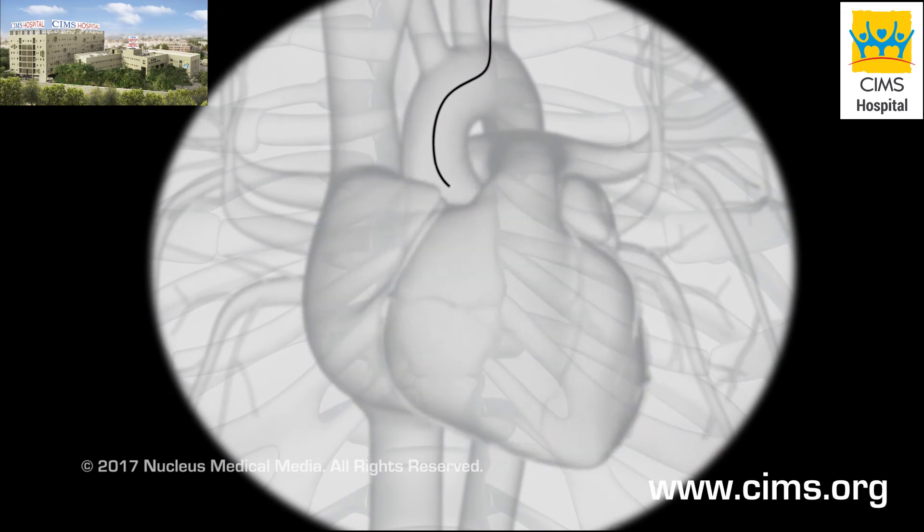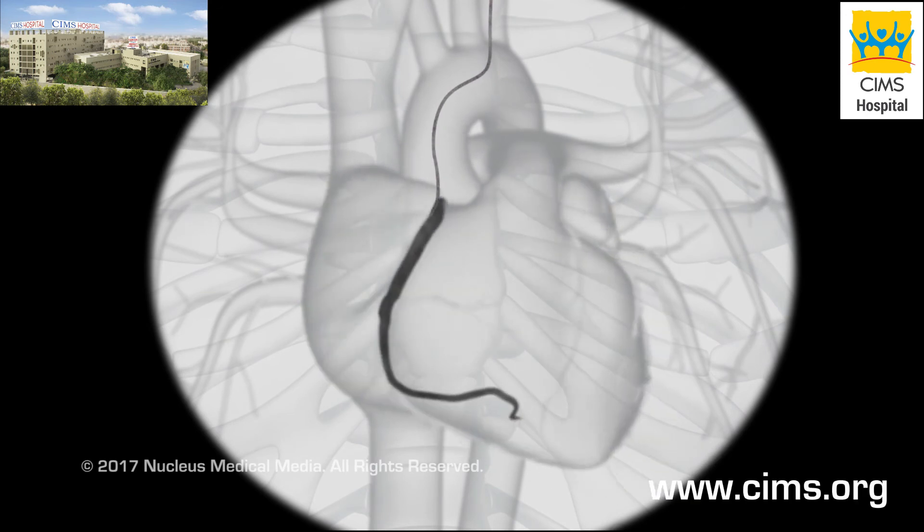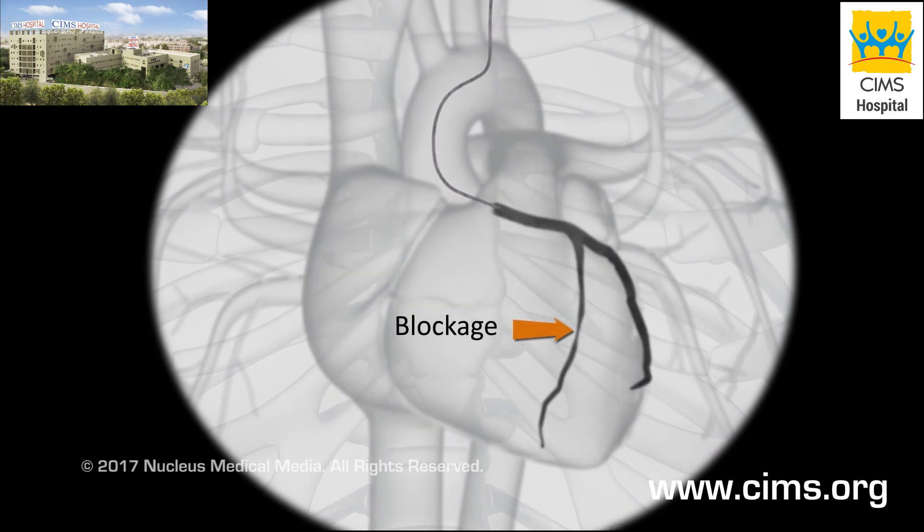Once the catheter reaches your coronary arteries, the wire will be removed. The catheter tip will be placed just inside each artery to inject a special dye. This dye allows the fluoroscope to take x-ray pictures of your arteries, called angiograms. Any blockages will be clearly identified as the arteries fill with dye. You may feel flushed, or slightly nauseated, when the dye is injected.